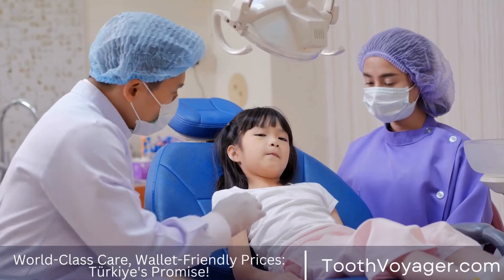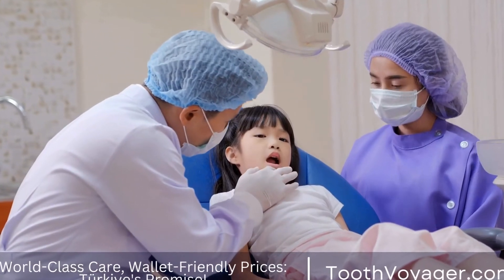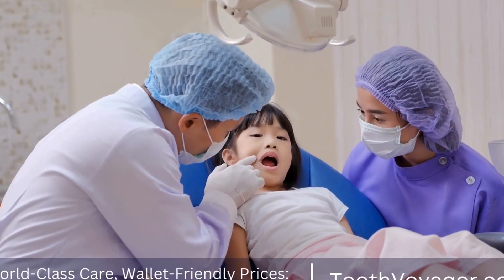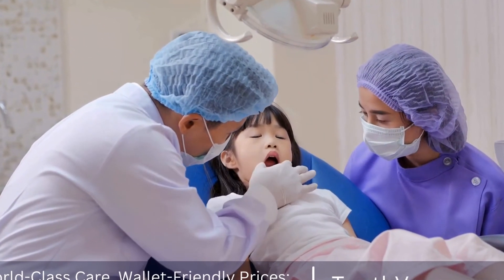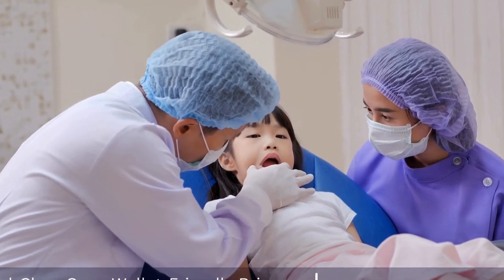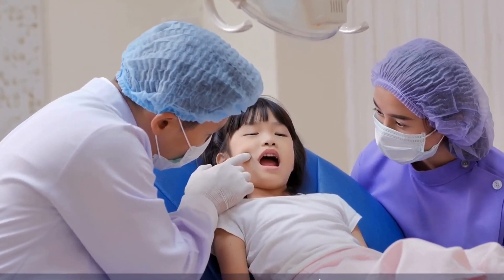Step 1 — Examination and X-rays: Before the procedure begins, the dentist will examine the tooth and take x-rays to determine the extent of the damage and the shape of the root canals.